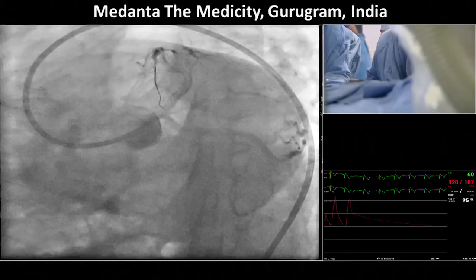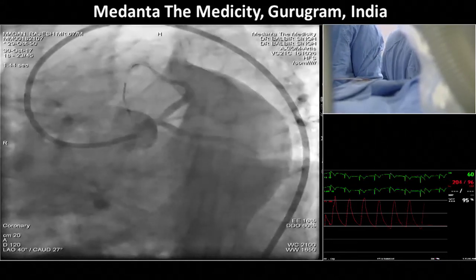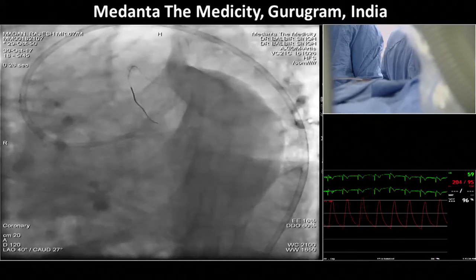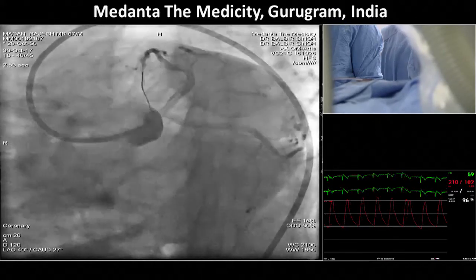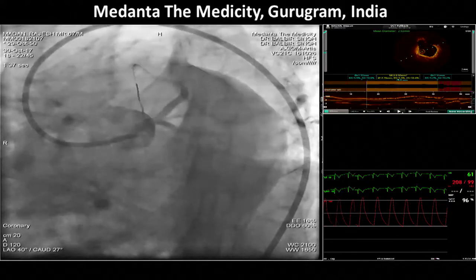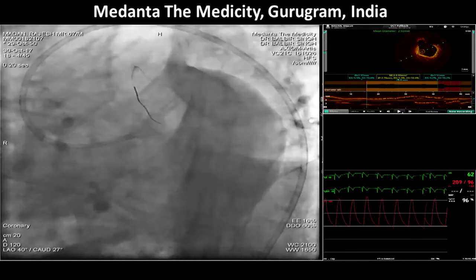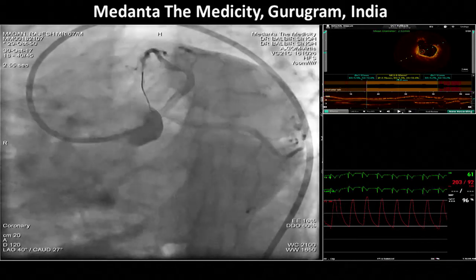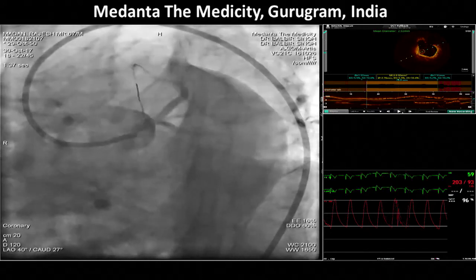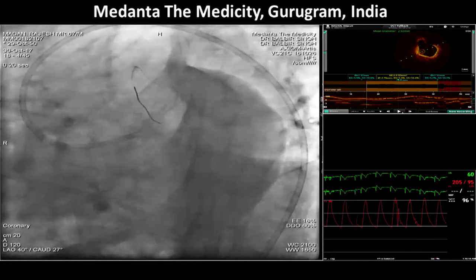So this is the angiographic picture. The left main stent seems to be nicely flared up. The ostium of the LAD will need some more dilatation with a 3.5 millimeter balloon. And the circ ostium appears really good. So I'm not going to do a kissing balloon or another stent. So how many on the panel think a kissing is a must here? Or we can just go ahead and finish this case? We have 2 minutes left. Yeah, I think we have 2 minutes.